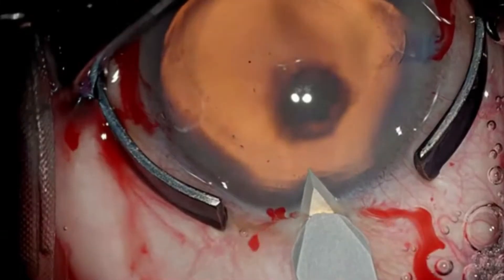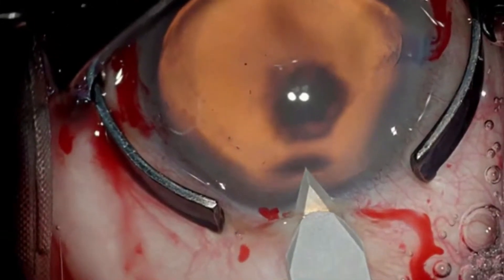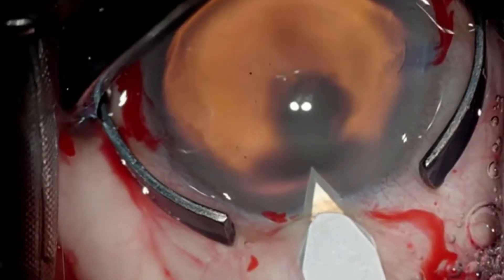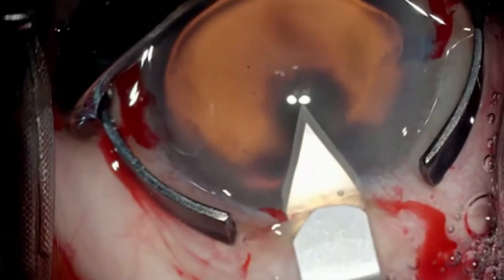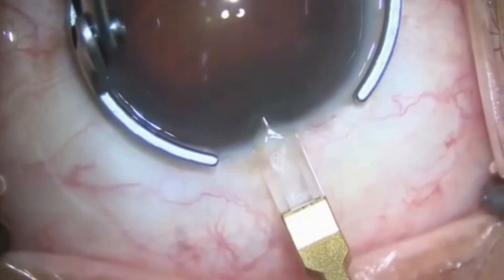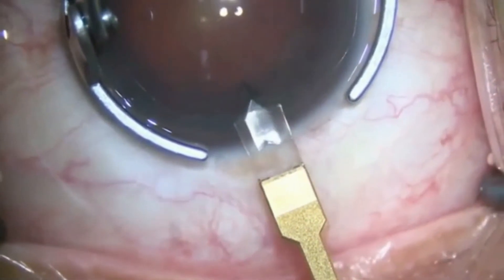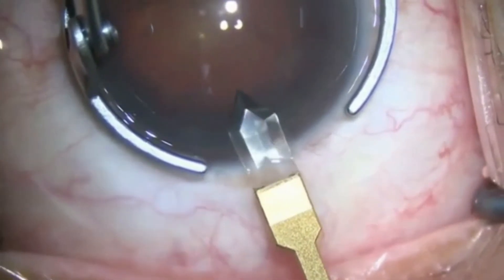These forceps have the advantage of not injuring the conjunctiva or perilimbal tissue, so the eyes do not have redness after the surgery, which is an important issue in modern cataract surgery practice.